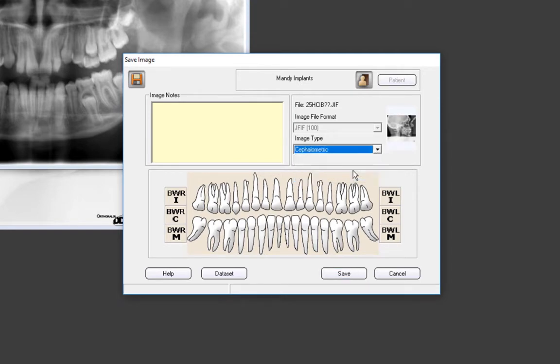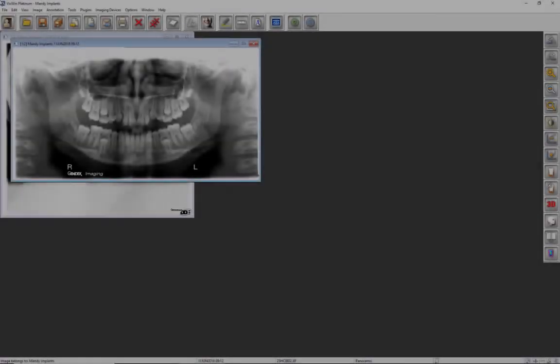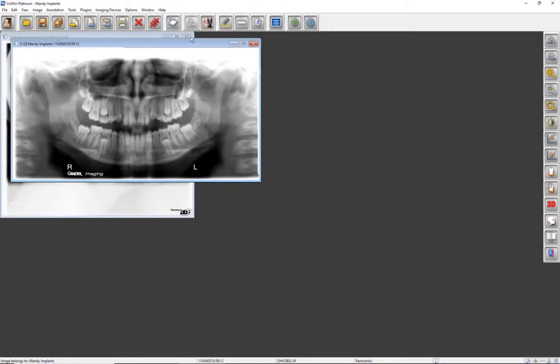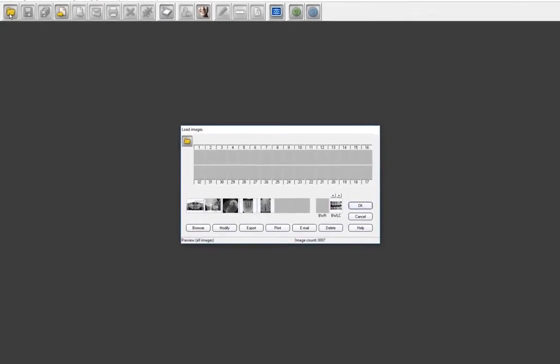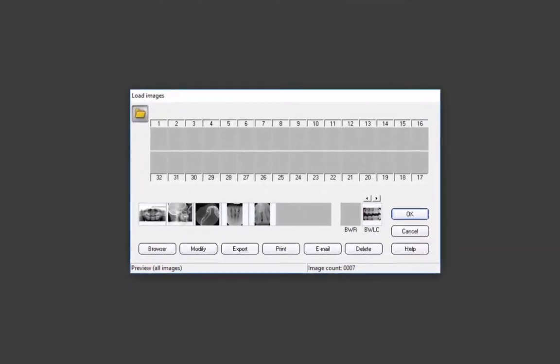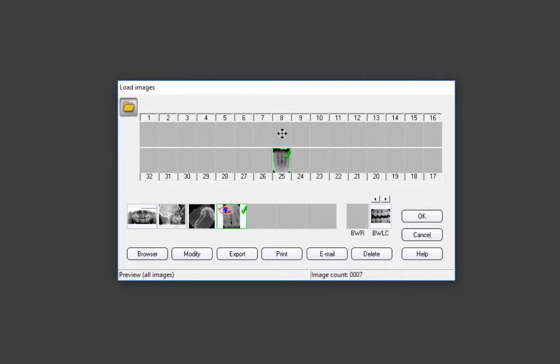The dialog window will disappear and we will be back in the user interface. Let's close the images and select Load Images again. There have been a couple of periapicals taken since we last viewed the Load Images window. Let's drag the x-ray to the mouth. There is also a CBCT scan taken. When a 3D scan is taken through VIXWIN, a thumbnail image will be saved.